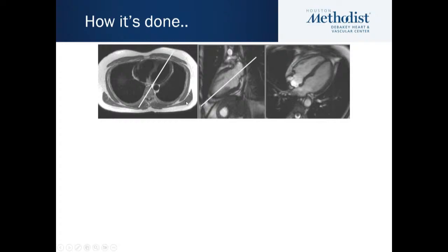So how we do this is a little bit different than CT. For CT, think about it, you're acquiring sections of the body from top to bottom. Here, it's essentially an acquisition through those planes that we alluded to. So you get a plane that covers an axial slice of the body. You draw another plane that creates what we call a pseudo two-chamber view. So you have LV and LA, and then you create a third plane that has the four-chamber view.